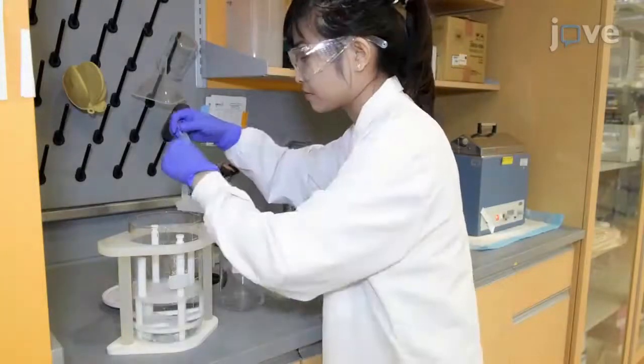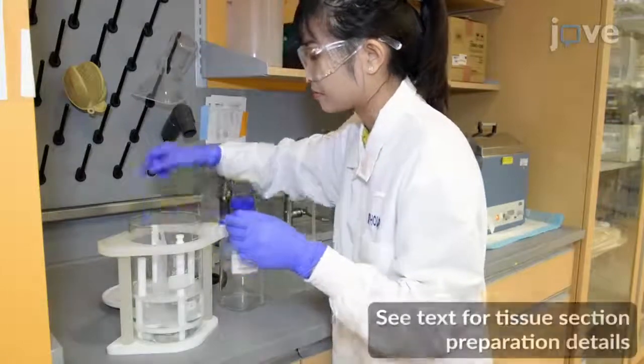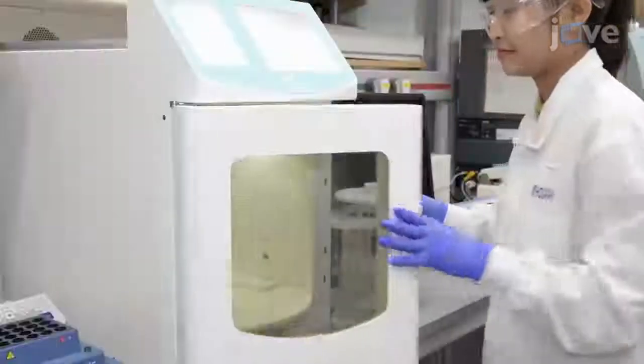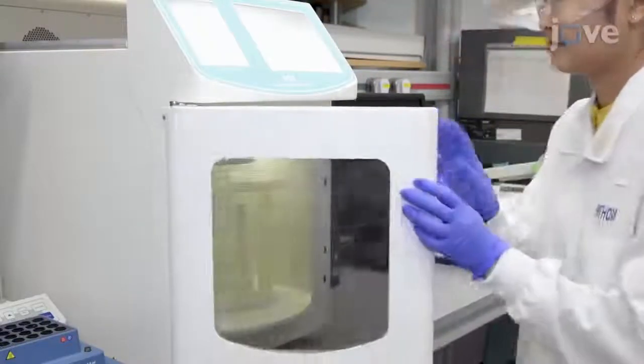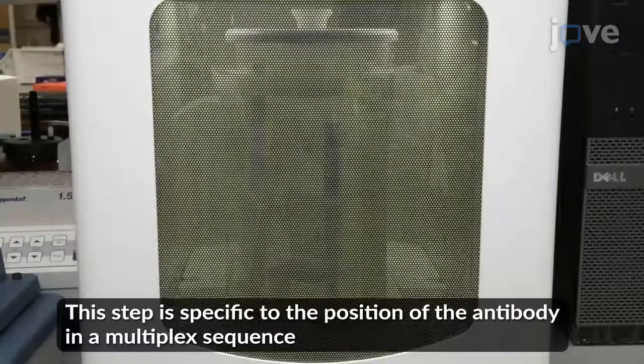Begin by immersing the de-waxed and rehydrated slides in a standard antigen retrieval buffer in a microwave-safe glass jar and performing heat-induced epitope retrieval in a suitable microwave. Perform additional rounds of microwave stripping, based on the position of the antibody in the final multiplex sequence.